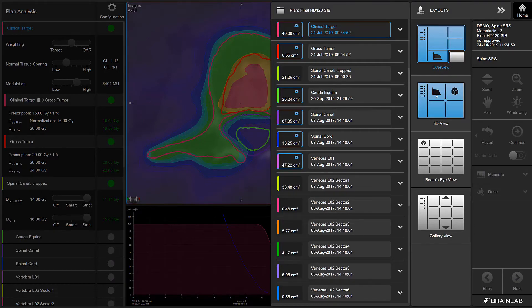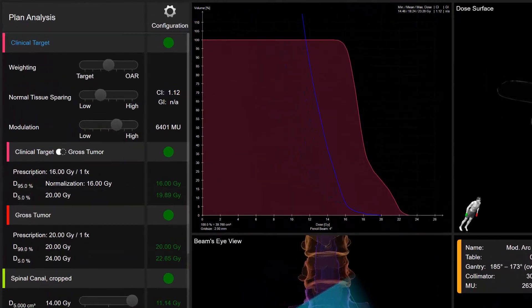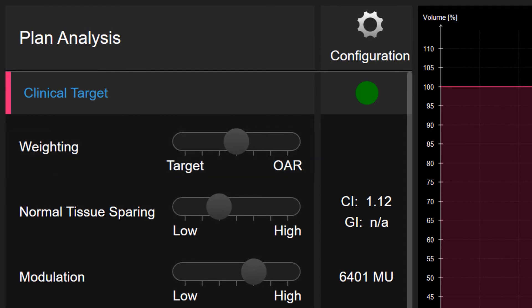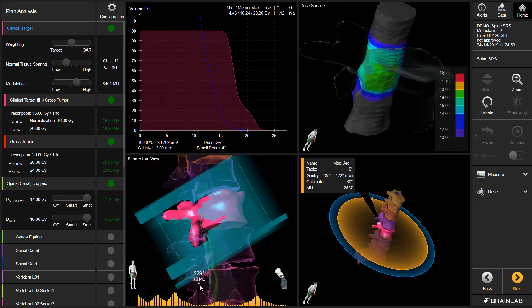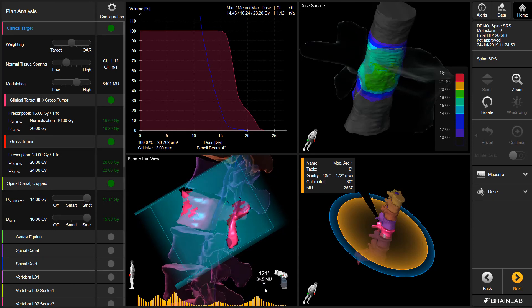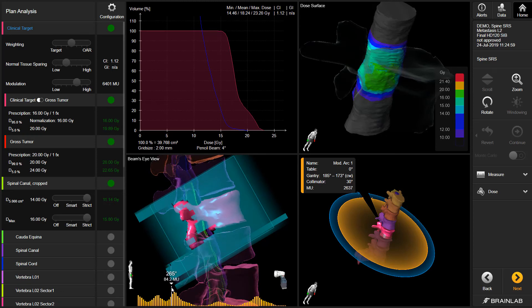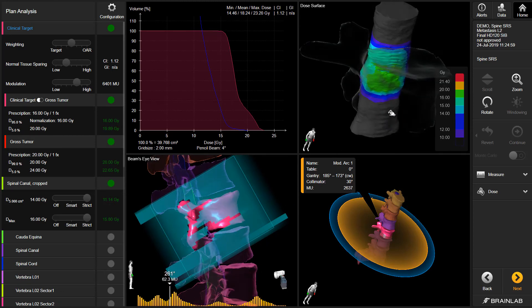Once plan optimization is complete, users are offered a range of intuitive tools to personalize the plan. These include the ability to dynamically adjust the priority between the target and the most critical organ at risk. The dose gradient is expressed through the normal tissue slider as well as the modulation. The beam's eye view shows how the algorithm has selectively blocked parts of the vertebra to achieve a highly conformal dose, while the dose surface view volumetrically depicts the steep dose fall-off at the vertebrae-spinal cord interface.